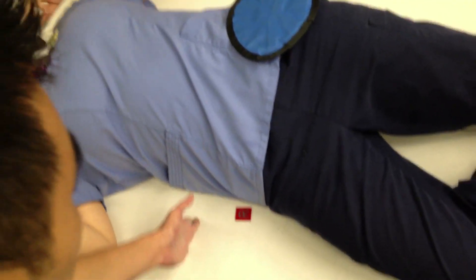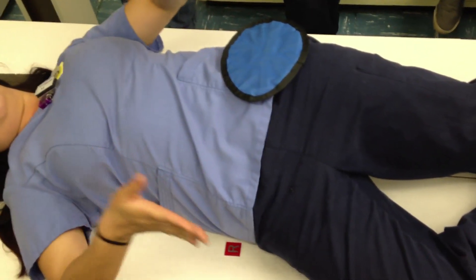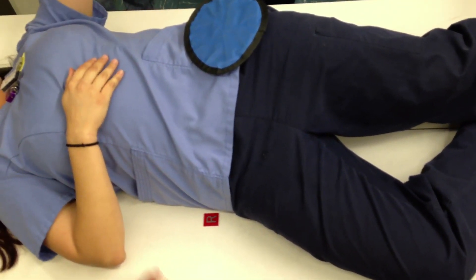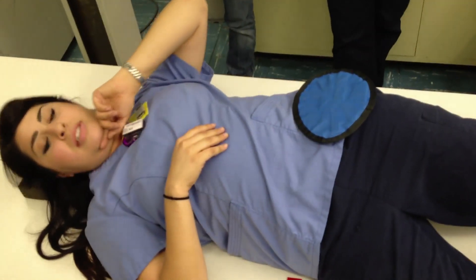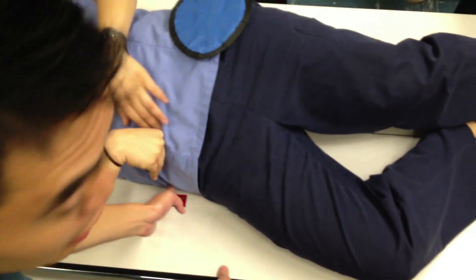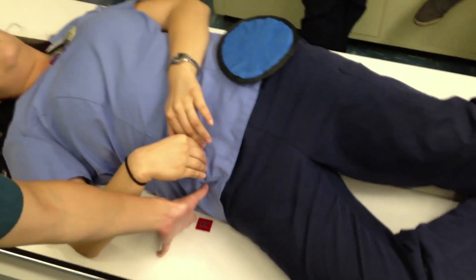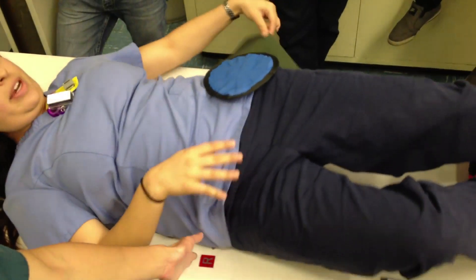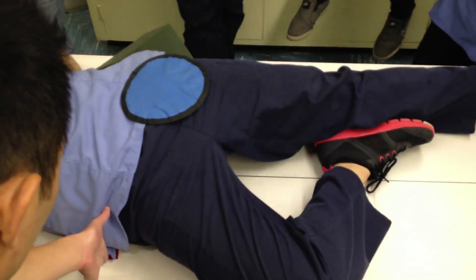For your collimation, I normally just open it up to 10 by 12 and make sure the top is set at ASIS. He's already positioning, and at the very end just align the collimation line. The ASIS is right at the top — so the top of the cassette is right at ASIS. The thing with this view, they're not so much concerned with the crest — ASIS is just ensuring the acetabulum is included, because that's the area where there's a lot of trauma. If the patient was able to do a frog-leg position, you could do it that way too.